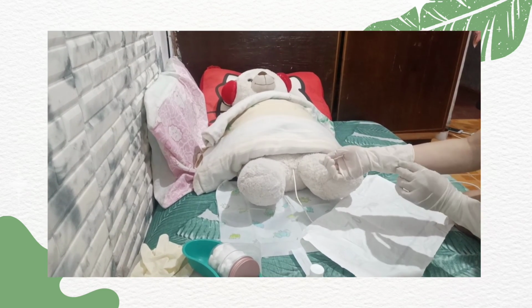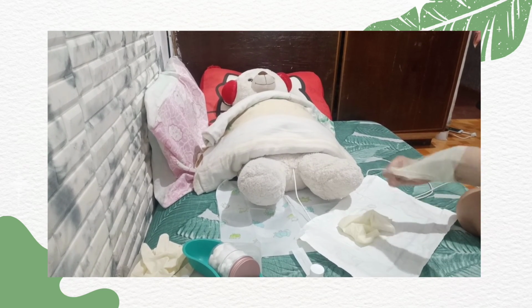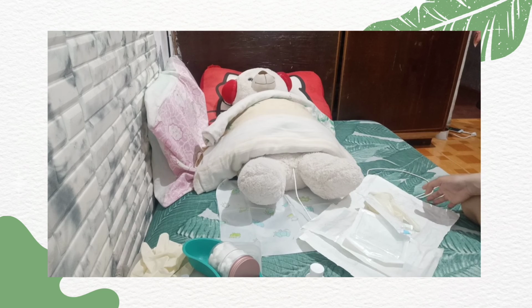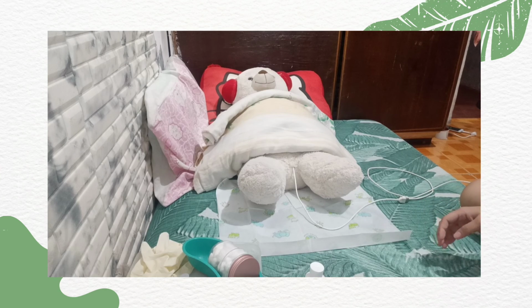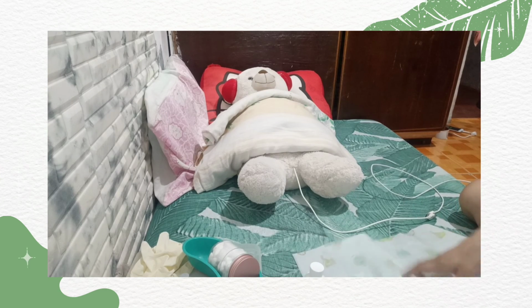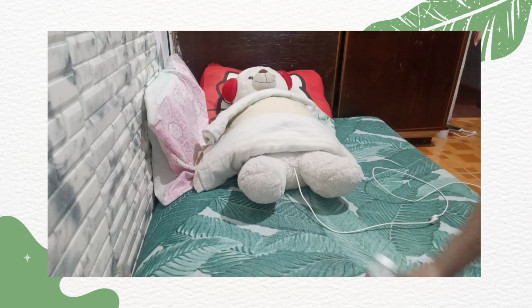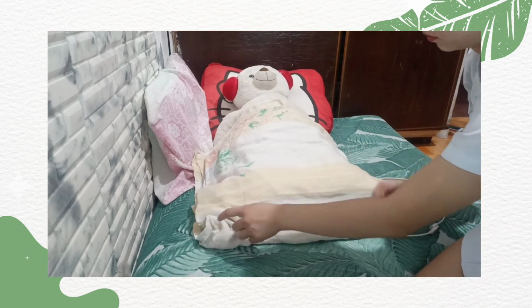Now let's remove our sterile gloves, and then discard all the used equipment. And then last, we are going to document the catheter procedure, including the catheter size and the results.